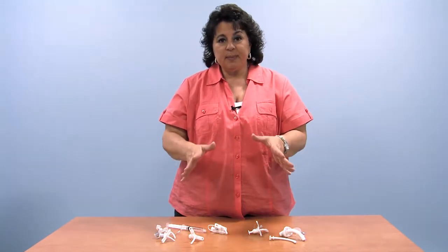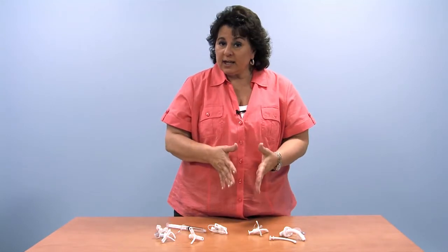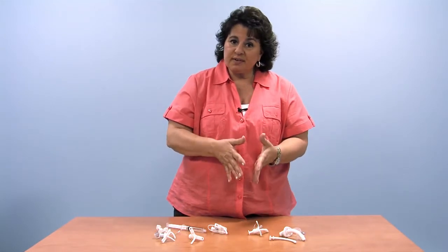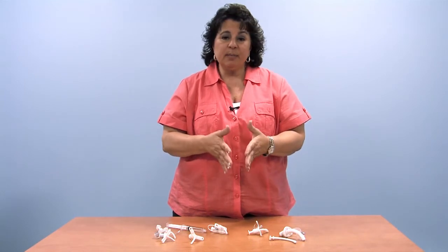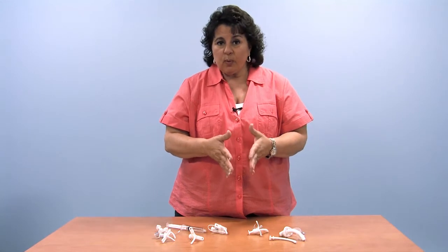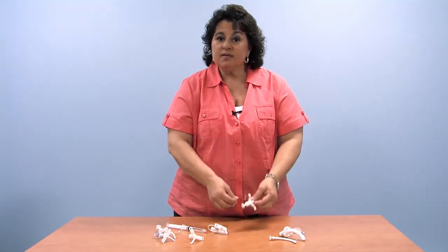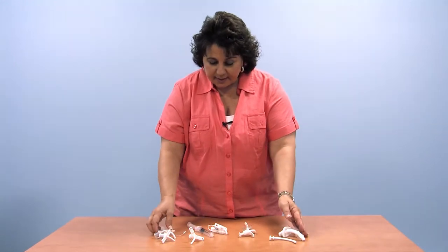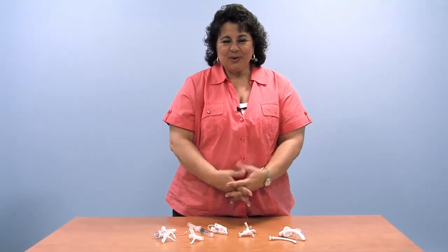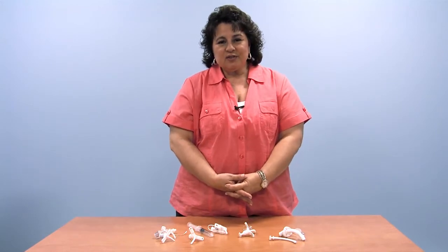About what tube best suits the needs of your child. And that need may change. It may change whether they're on a ventilator or not on a ventilator. It may change by the type of ventilator they're on. Some work very well without the added cuff. Some do not. And it really depends. So I urge you to please ask the questions, receive the answers, and then make decisions for your child.